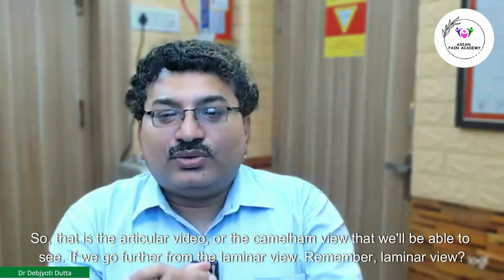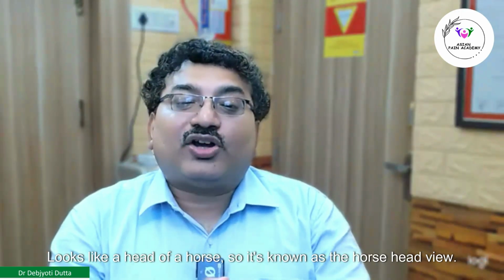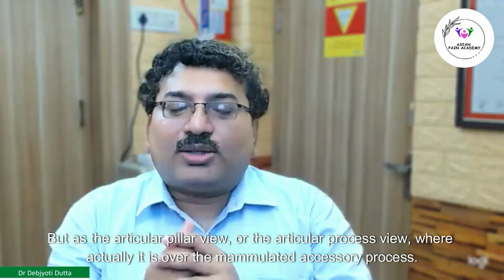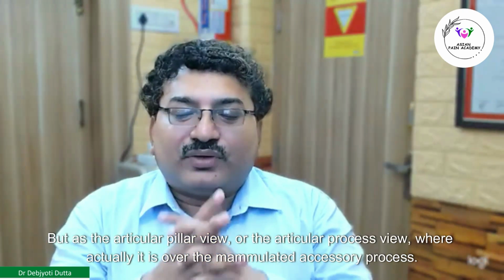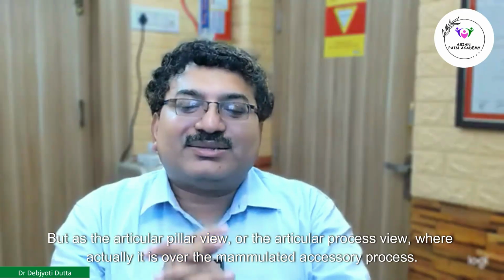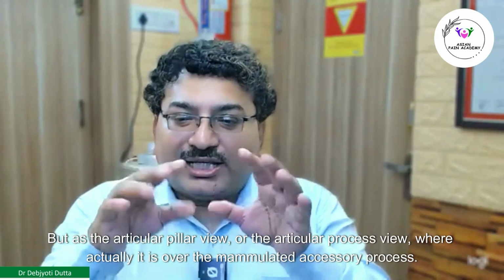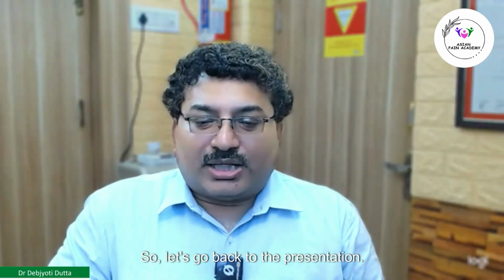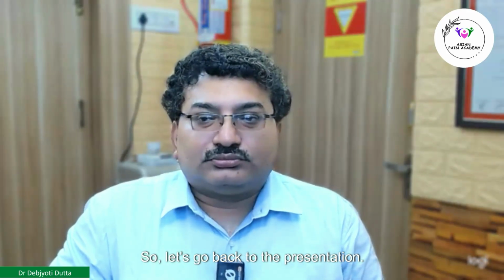Remember, the laminar view looks like the head of a horse, so it's known as the horse head view. Whereas the articular pillar view or the articular process view, where it is over the mammillary and accessory process, looks like a camel hump, so it is known as the camel hump view. So let's go back to the presentation.